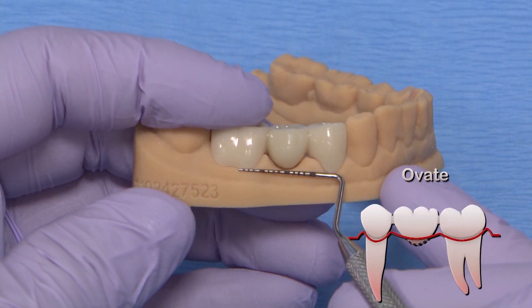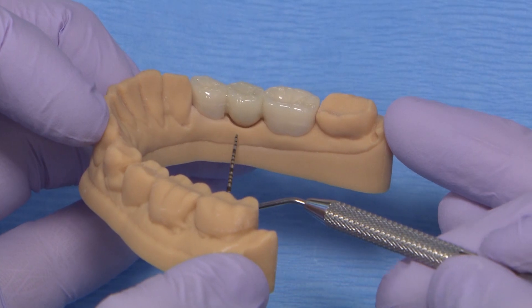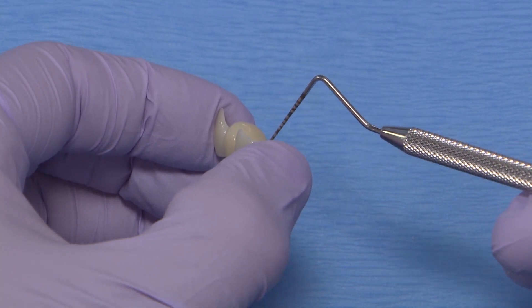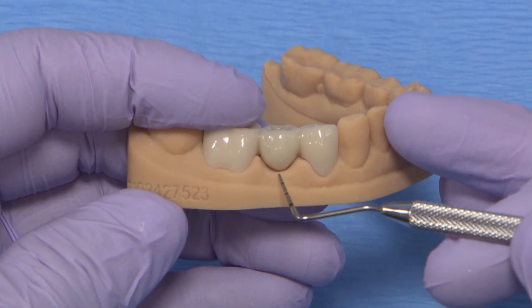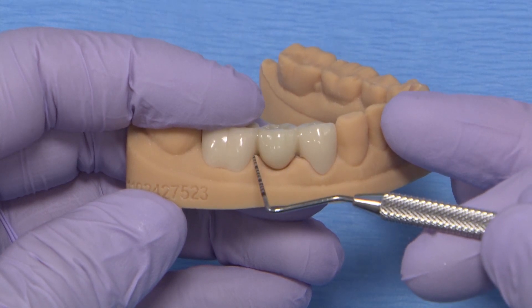The ovate pontic design is ideal for the anterior; however, it's not limited and can be used for posteriors because it is highly aesthetic and low maintenance. This design creates a bit of a depression or an indentation in the residual tissue ridge so that it mimics the shape of a natural root and crown. The pontic looks like it's growing out of the gum tissue and just not resting on top of it.